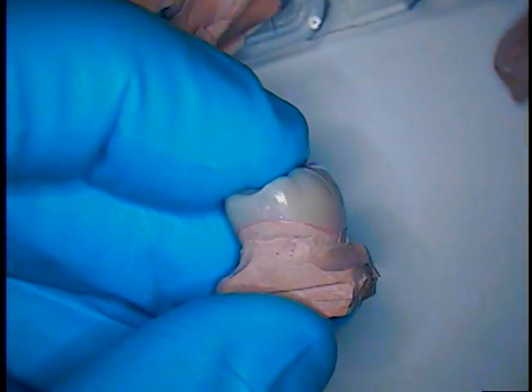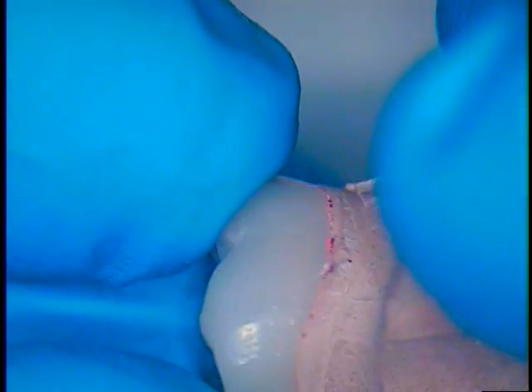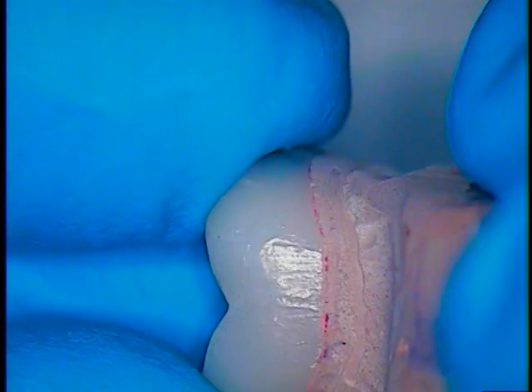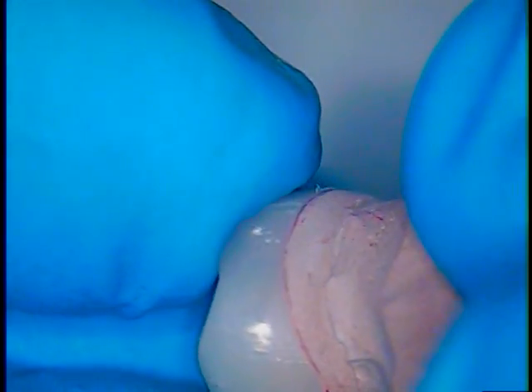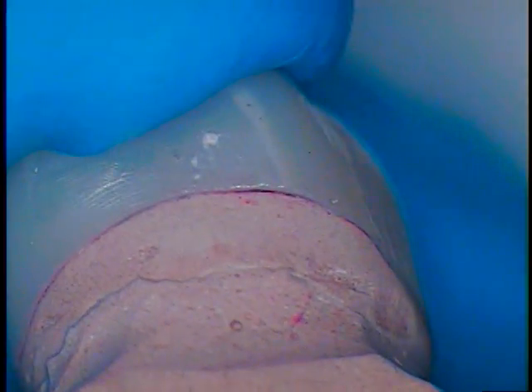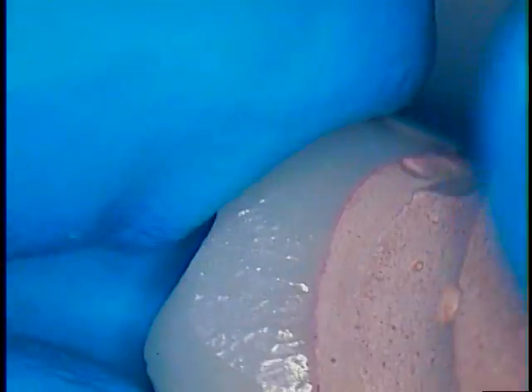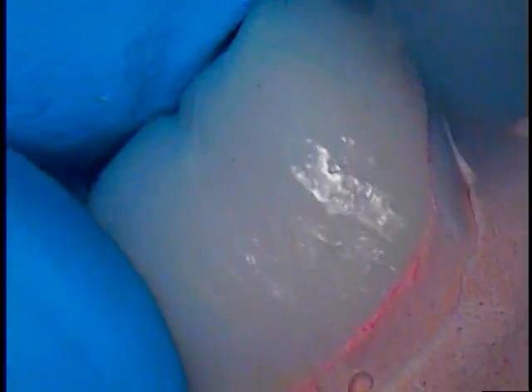So this is it under the microscope. Now you're going to see this is the handmade die and the crown that fits the handmade die, and you can see it's pretty flawless. I can't see any significant daylight coming through underneath this margin. Maybe just ever so slightly there. Again, looks like the scan and the handmade are almost identical to each other.